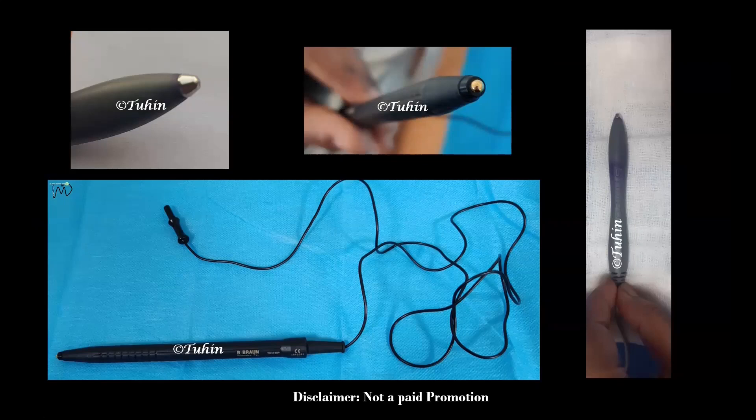From my personal experience, the sensation is felt like a kind of tingling, pin prick, electrical shock, or burning. Depending on the stimulus amplitude and duration, it might be uncomfortable or even painful, but it does not cause any kind of injury to the skin or the nerve.